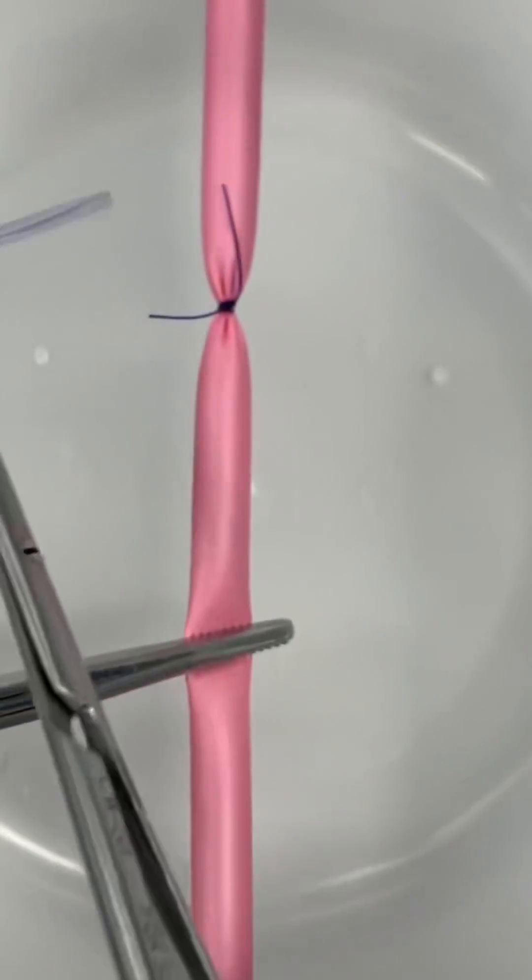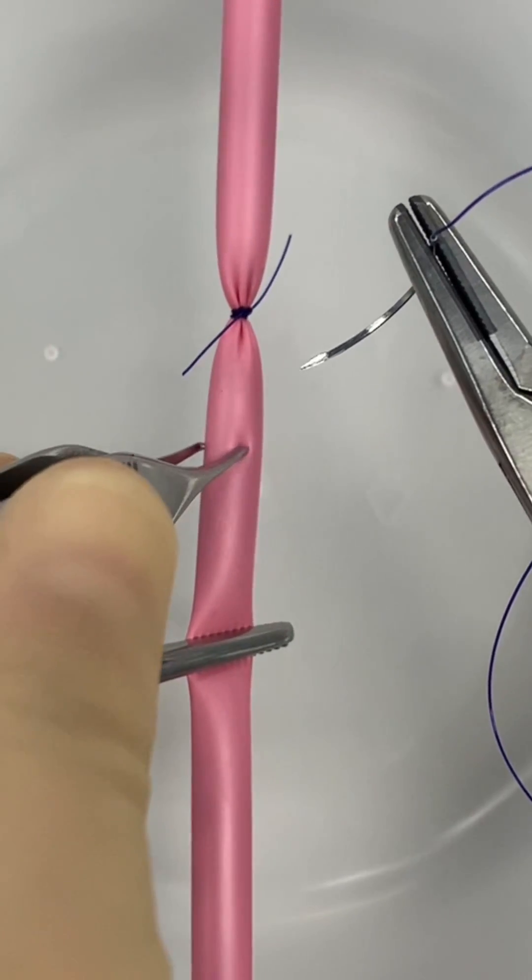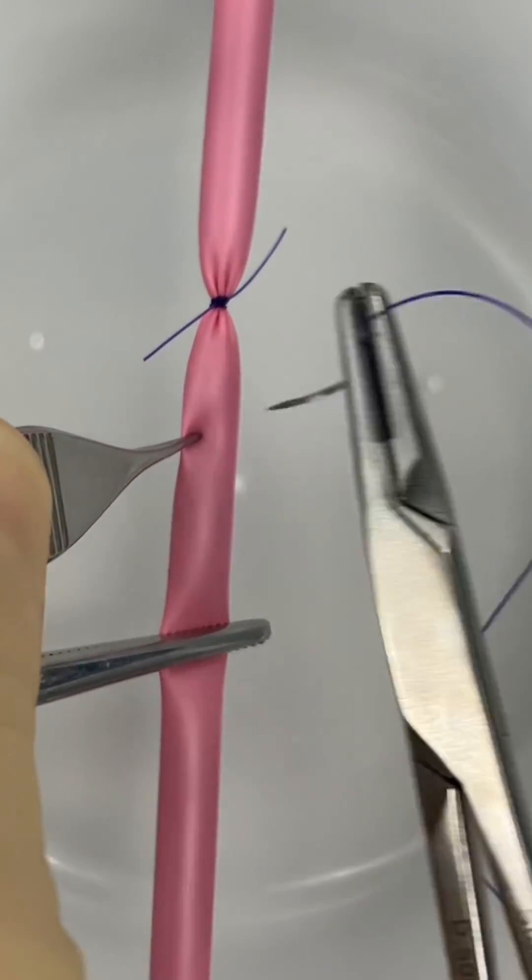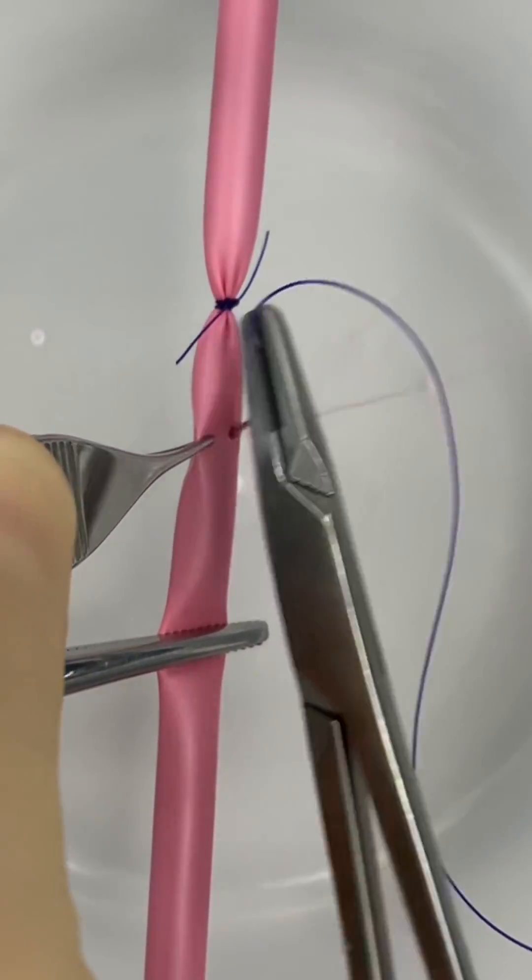Now that you've constricted blood flow, you can complete the ligation with the transfixing ligature. This is placed distal to the constrictor knot because it involves going through the vessel with a needle.